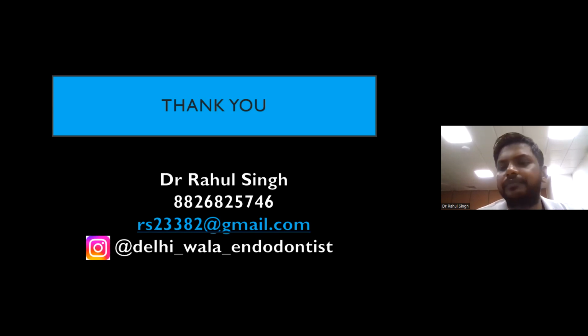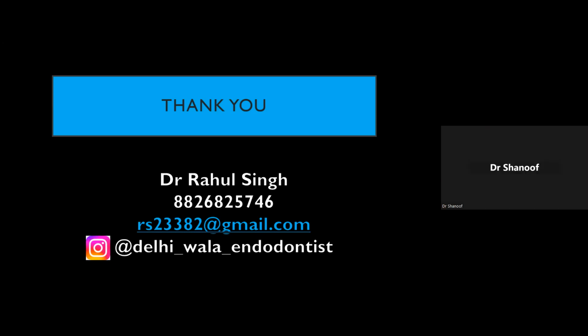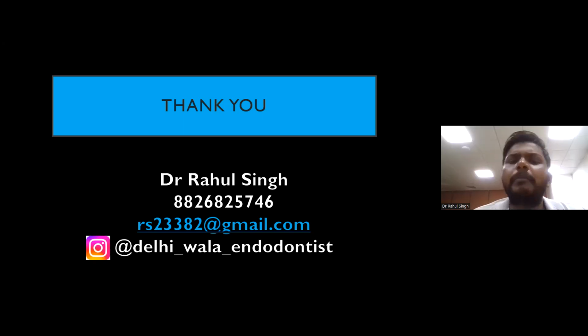That's all. Okay, sir. So another question is, what's your opinion regarding the single cone technique with bioceramic sealer? Bioceramic sealers are the mainstay nowadays, and we are using bioceramic sealer daily. But using it with a single cone is fine, it all depends on your preparation size actually.